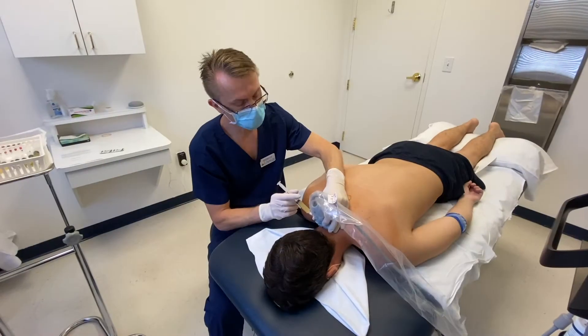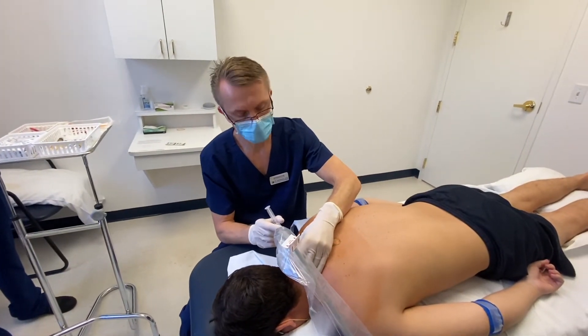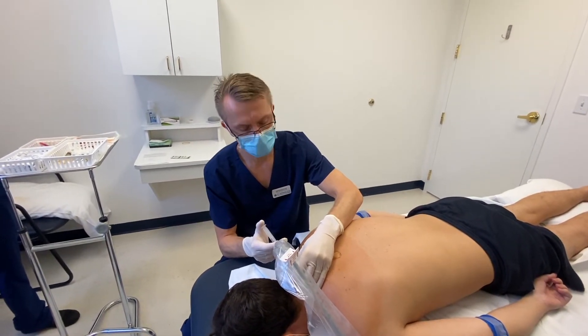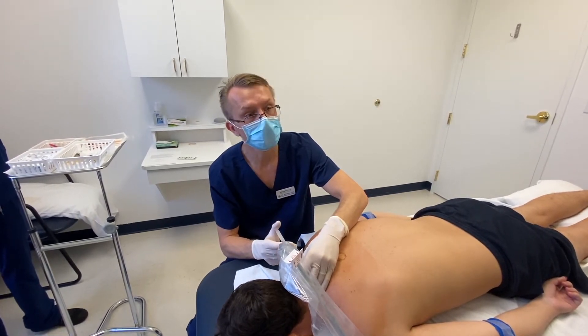What I'm doing is injecting level by level. We started around the C3 vertebrae and I'm moving down to C5 right now. At each level, I'm injecting a little bit of PRP into the facet joints and into the surrounding ligaments.